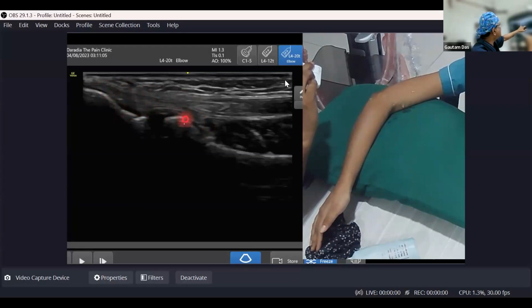And here is your annular ligament. Annular ligament I'll also be showing you in the other axis as well. It intermingles with this. So the lateral ligamental complex, one is this part. So the upper part is your tendinous part, the lower part, which is coming below the tendon, is your ligamental part. And it intermingles with the annular ligament.